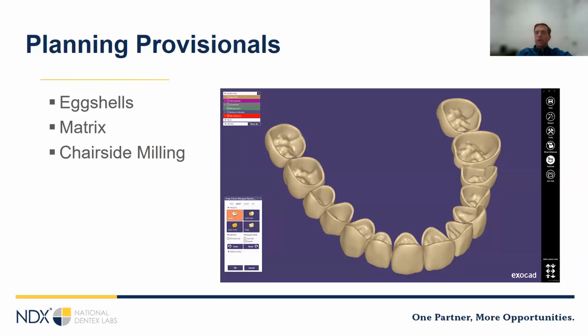The third method is if you have a chairside mill. What you could do ahead of time is scan your mock-up and make sure you got a big enough model to align to your prepared case. Then you prepare the case, scan that, align them together, and do a biocopy to mill out a bunch of PMMAs. That'd take a while to do, but it would give you the ability to have a really good fit and really good morphology. So I guess what I'm saying is that I don't think there's a one-size-fits-all solution. So make sure you talk to your laboratory and you guys make a plan that works best in both of your hands.